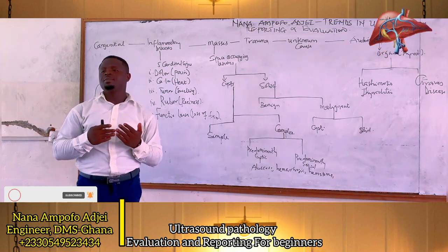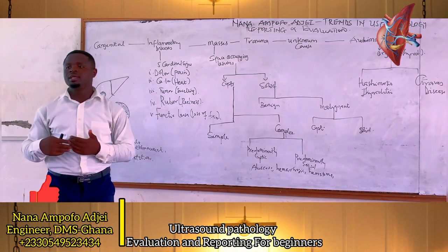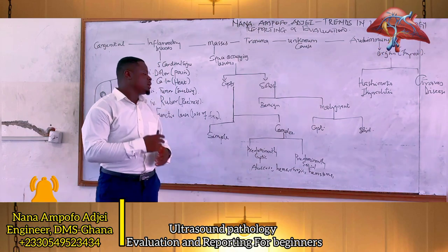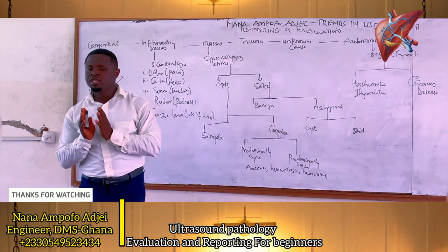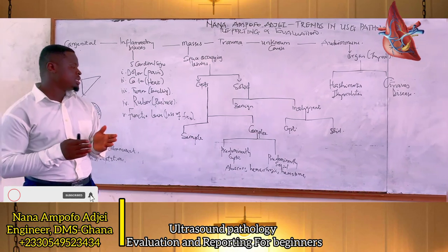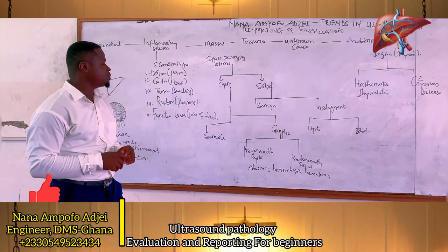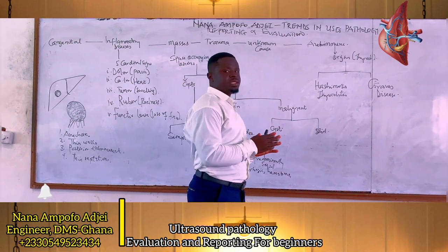Okay, now when the patient comes to you and complains about fever, right upper quadrant pain, then more or less you may consider an abscess collection. Okay, then if the patient comes to you with history of trauma or injury, either direct or indirect, then you may consider what? Hemorrhagic or hematoma. Are you okay up to this point? Okay. We also have solid component.